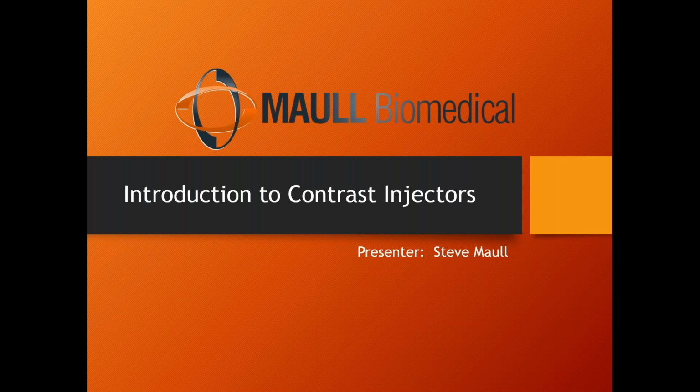The odds that an X-ray photon will penetrate a body part is determined by the thickness and the density of the body part. The thicker and denser it is, the more likely that bone is going to absorb the X-ray. The less thick and dense, the more likely the X-ray photon will pass through and strike the plate and turn that area darker.